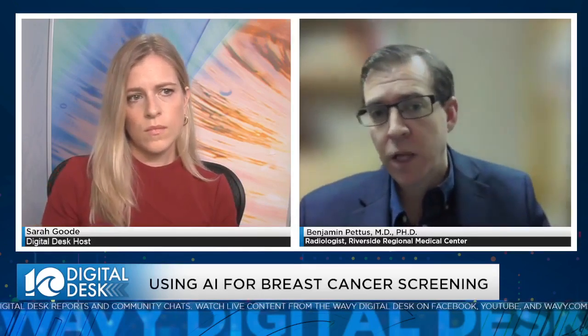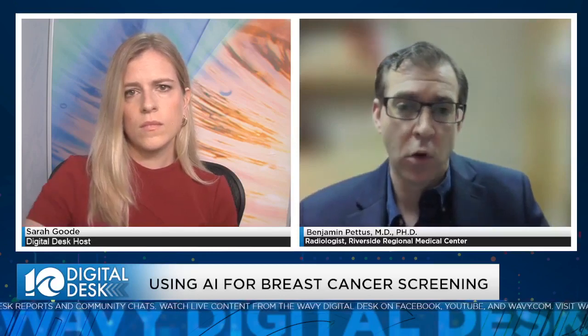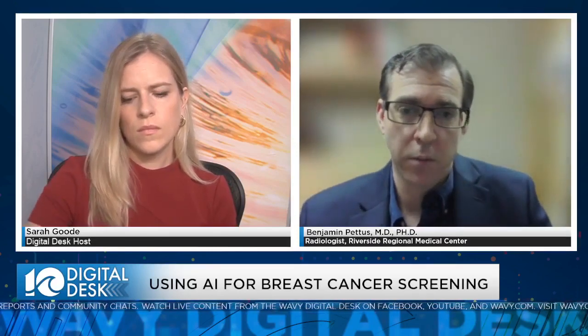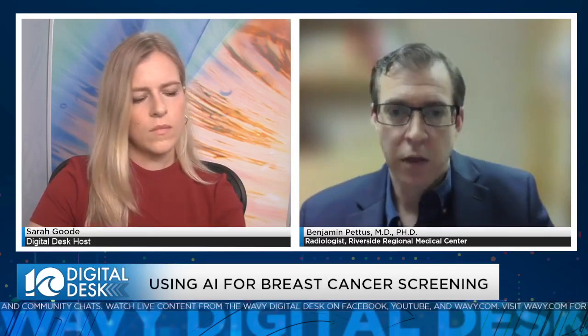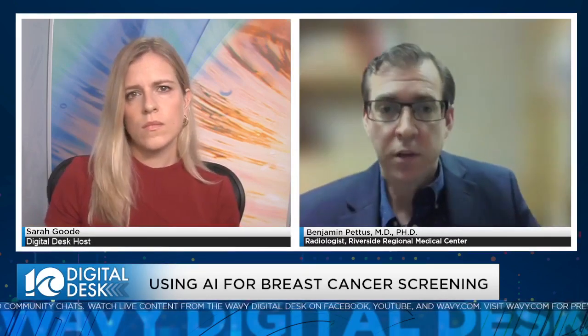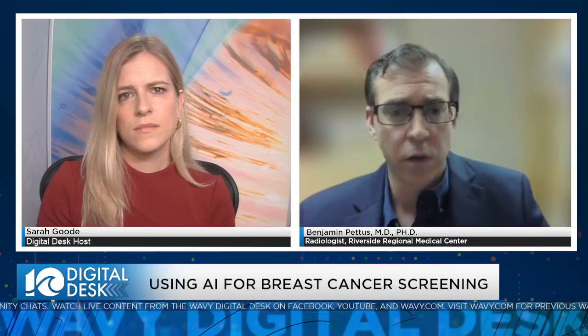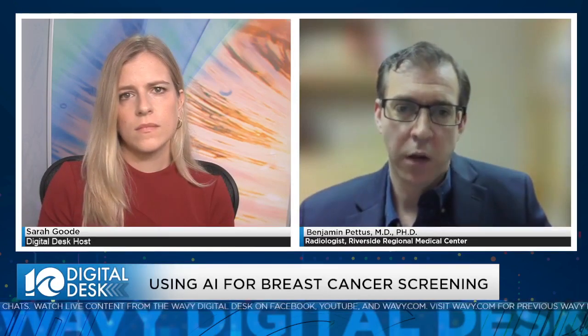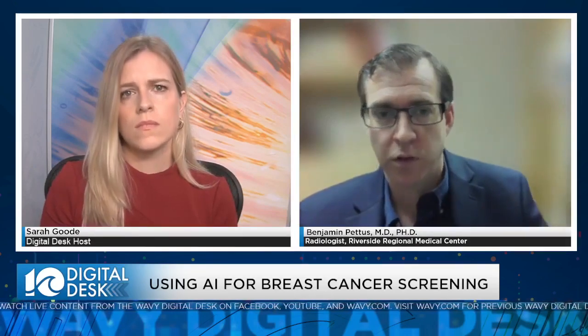So basically, what that does for us is it goes over every image of all of the cases that we've done, and it'll score as a likelihood that some finding on the image could represent a cancer or not. There's limitations to what the AI can do because it's not comparing to the prior films, and it's not really comparing the different views within the same breast, the top-down view or the side view.